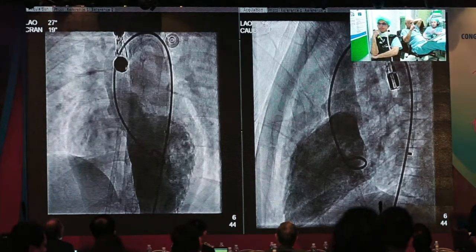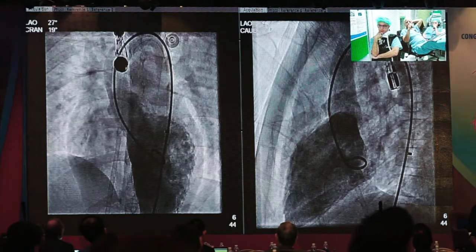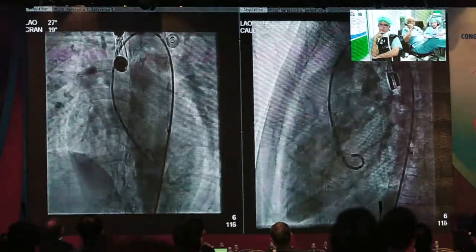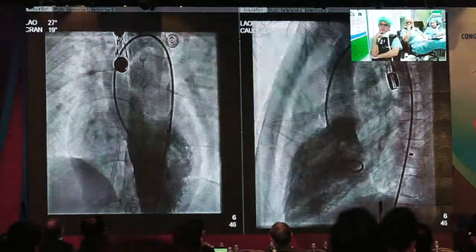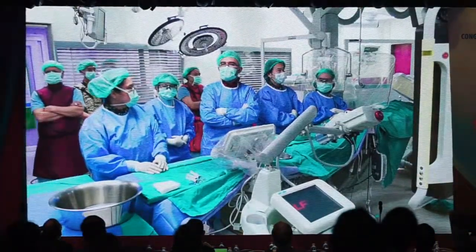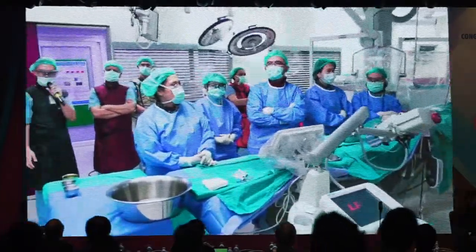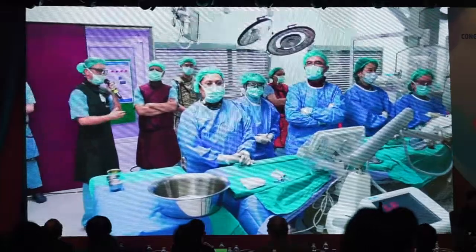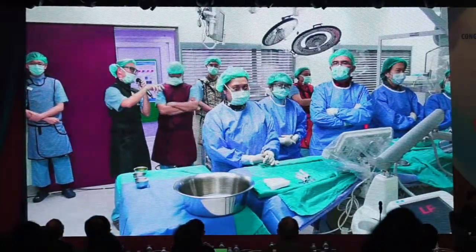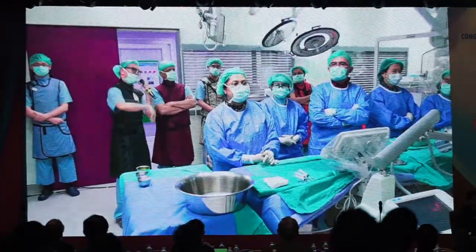So we will measure again after we do the angiogram when the sheath is across the defect. Why is it the same with you? Your opinion, I mean, in your daily practice? Yes. We check both the TEE and also the angiogram. In this patient, I would like, if I can, to do a little bit more LAO and cranial to show the four chamber view, because I think the angulation does make the angiogram look smaller than the echo.